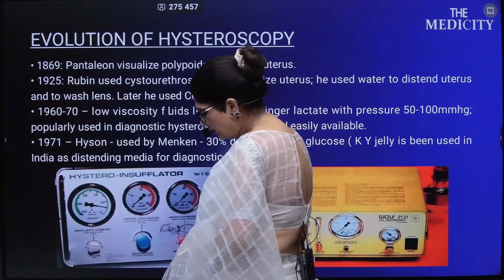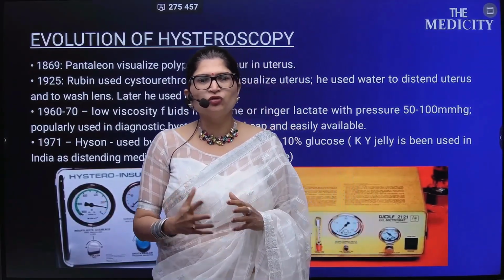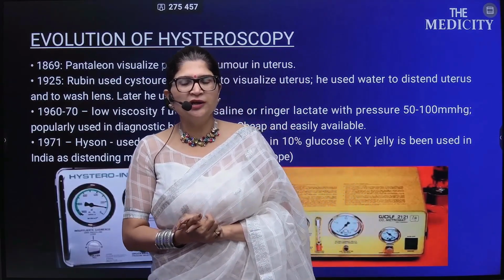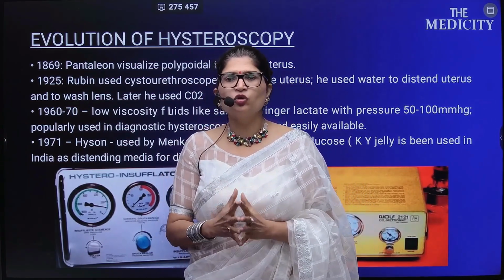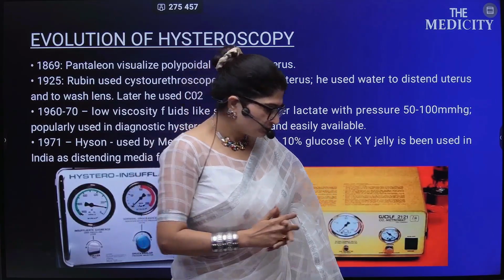Now, as every skill evolves with time, hysteroscopy has also evolved through the years, and at present we are dealing with the latest equipment and the latest techniques, using hysteroscopy for all the surgical procedures in gynecology.